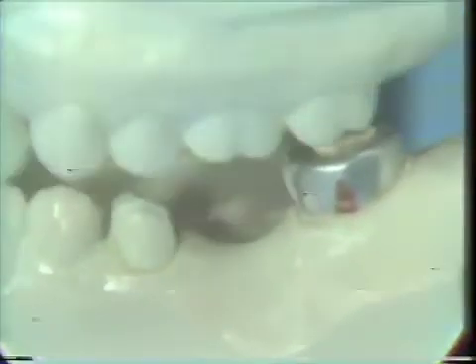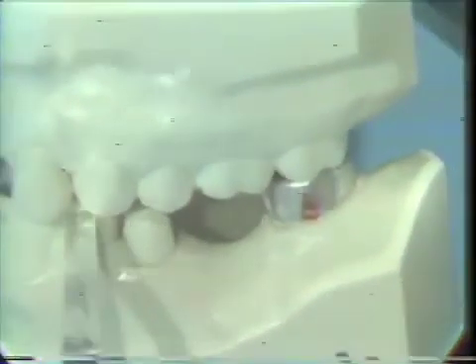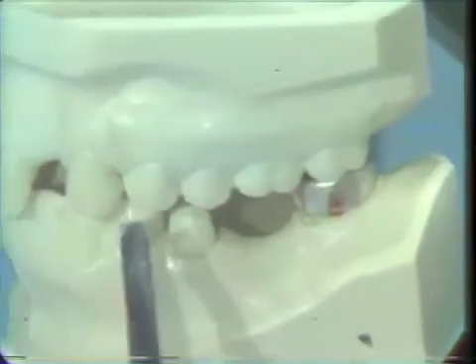When the material begins to polymerize, we will remove it so that we do not damage the pulp, and then we can check those key teeth again, which we checked originally with our shim stock, to make sure that they are still in occlusion.